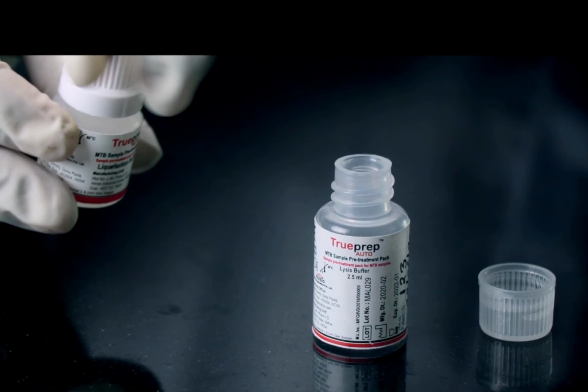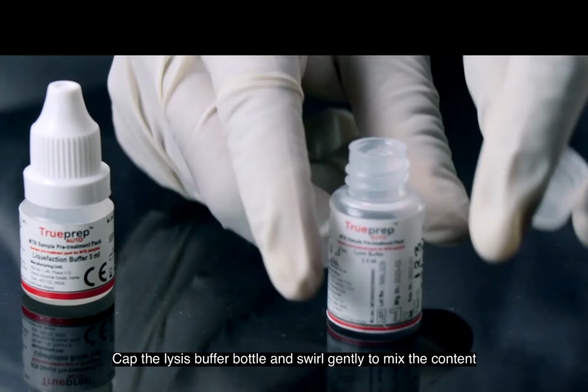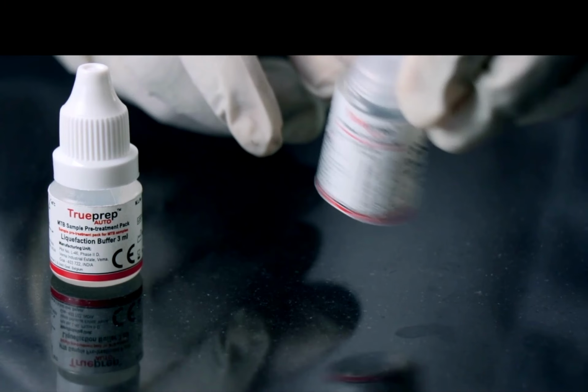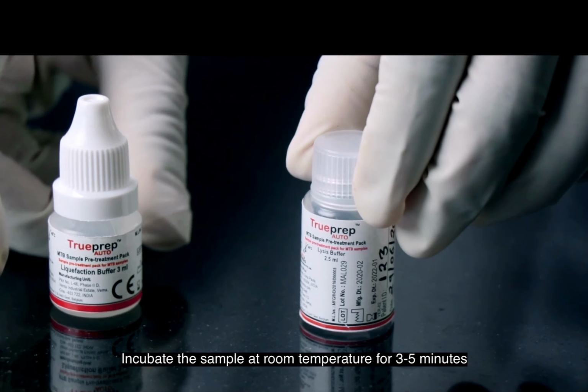So when you have a very low number of tests and you don't do these tests frequently, we have found in one of our troubleshooting that the LT just leaves it in the open. So what will happen if it is exposed to sunlight a lot? This also interferes with the buffer's quality. So once you have used this liquefaction buffer, you can keep it in the normal fridge area and then use it like every other chip. So once you have put 2 drops, slightly mix and leave it at room temperature for 3 to 5 minutes.